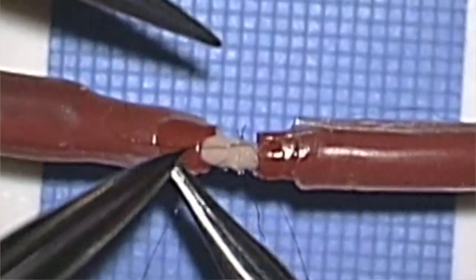Once leave one short, one long, and then I'll present the lumen as you take the stitch through, and just pick up that stitch and take it straight all the way through. Just move that hand away, and that knot is through. Make sure you supinate the hand so the needle goes in at 90 degrees, doesn't damage the intima. But my job as an assistant is also to show you the intima and present the lumen, make sure that we've got good throughput of the needle, back out the other end, and again put your stitches around in a circumferential way.